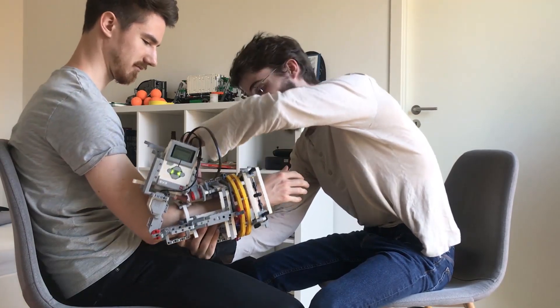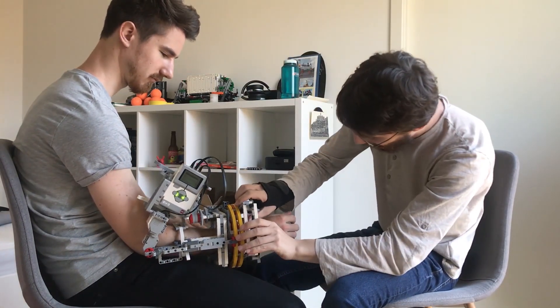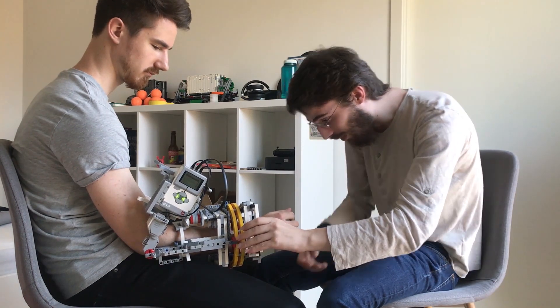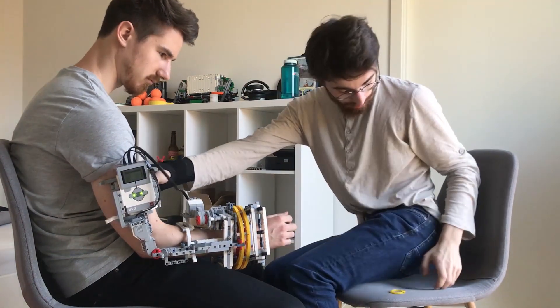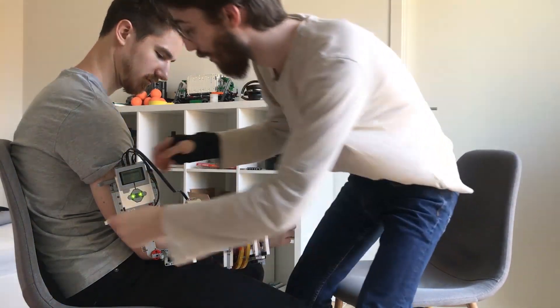Mounting the exoskeleton on a patient's arm is easy. First, the wrist rotating circle is secured by a squeeze and lock mechanism. After that, the upper arm part is folded onto the biceps. The prototype is attached to the arm using hooks and rubber bands.